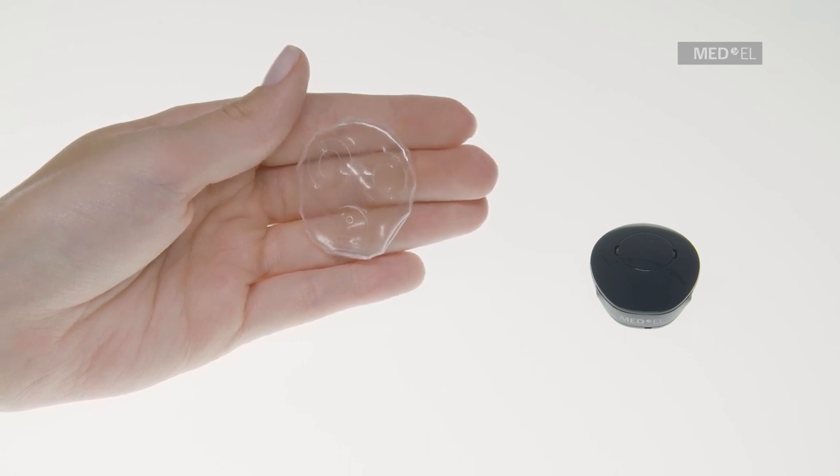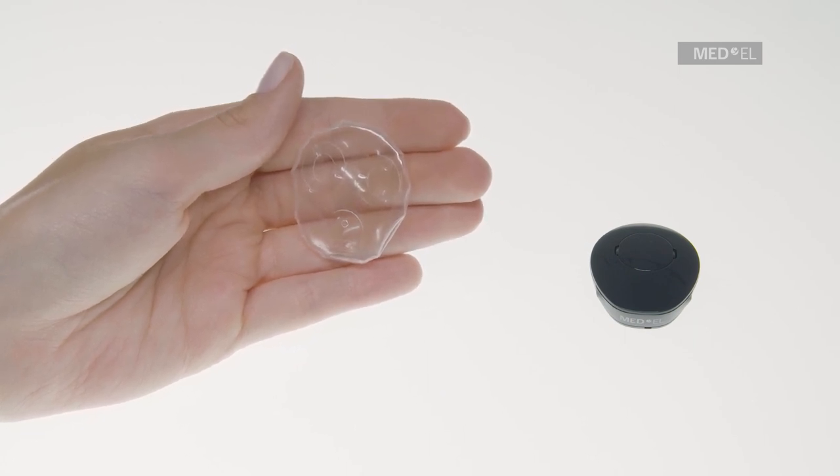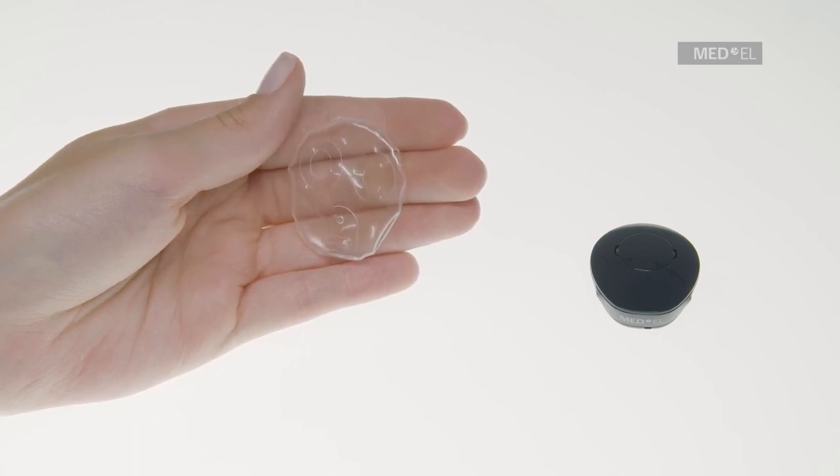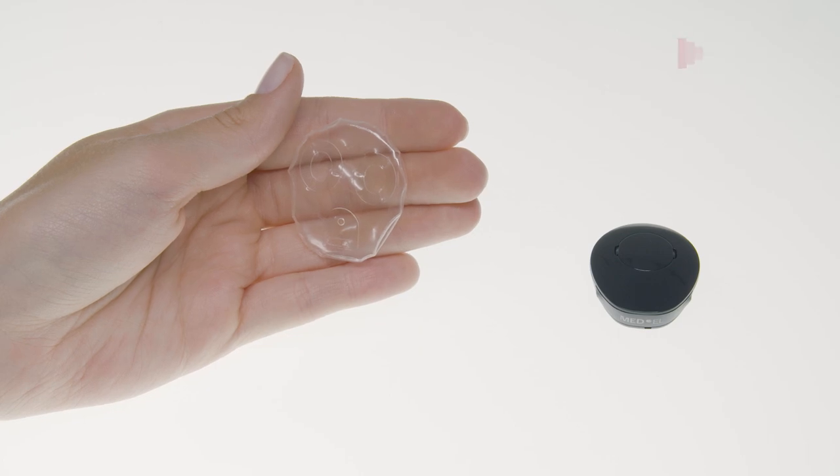Follow the previous instructions and ensure that the adhesive seal tape seals properly and that the Waterwear skin is not damaged before reusing.